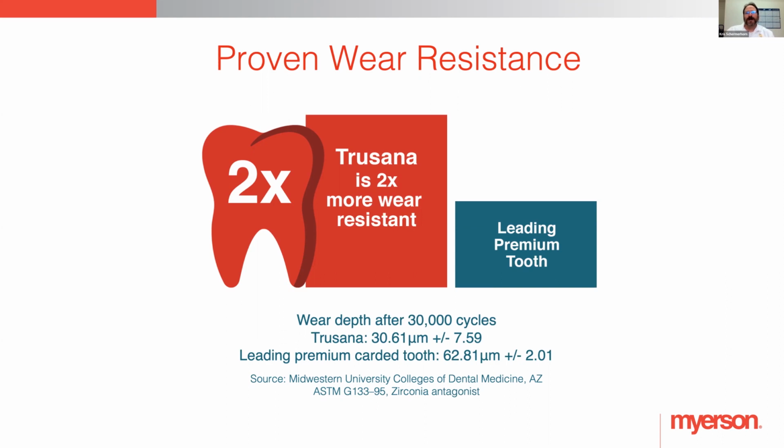The first thing I started doing when I did occlusal adjustments was use a carbide. And I'd go in there and I'd adjust cusps, and it was kind of whining on it. And it was kind of putting this dust off. And I learned real quickly that rubber wheels do a really good job, maybe actually a little better than the carbides, because the teeth of the carbide are trying to grab a chunk and take it off. That's what happens when you grind microscopically with a carbide, and it really just couldn't get the chunks that it wanted, and really wasn't removing the material like you wanted.